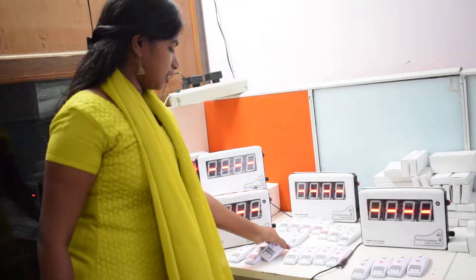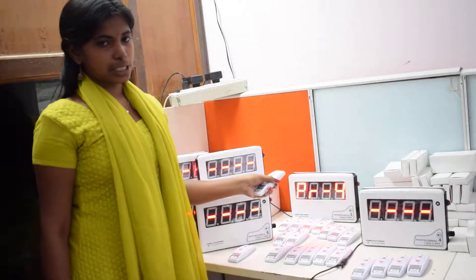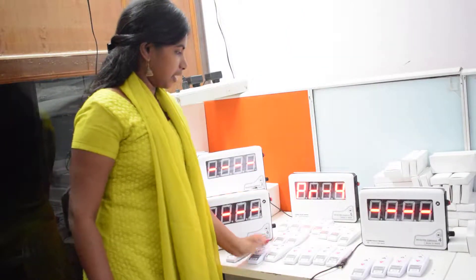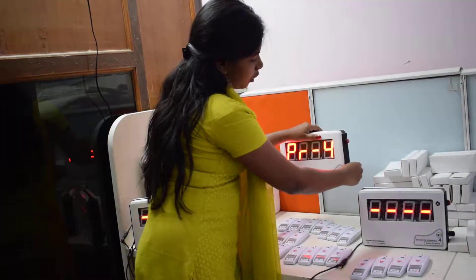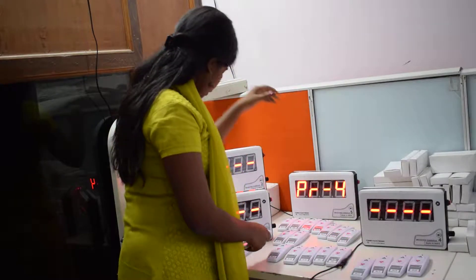It will be displayed in the room. You can add 4 numbers. It will display 4 numbers. You can add the volume. It will be displayed in the room.